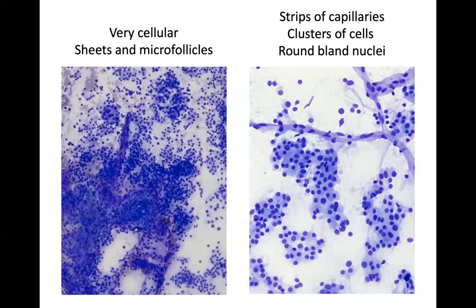Your concern is a follicular neoplasm, and your concern is follicular carcinoma, right? Because usually follicular neoplasms are highly cellular, colloid poor, and the difference between follicular adenoma and follicular carcinoma can really only be made based on histologic examination of the capsule, right? So this would be category 4. Follicular neoplasm or suspicious for follicular neoplasm basically means the same thing.